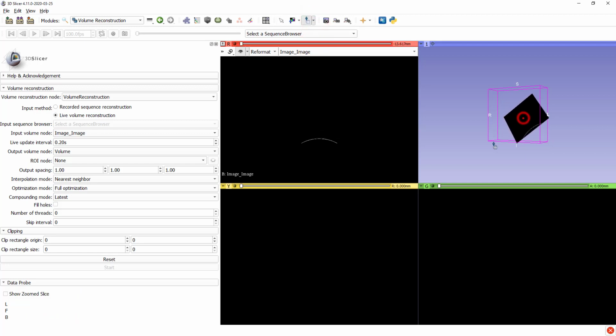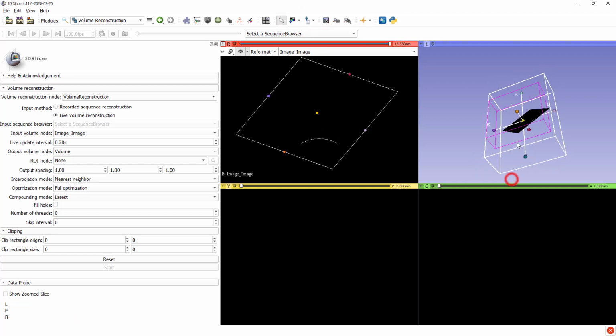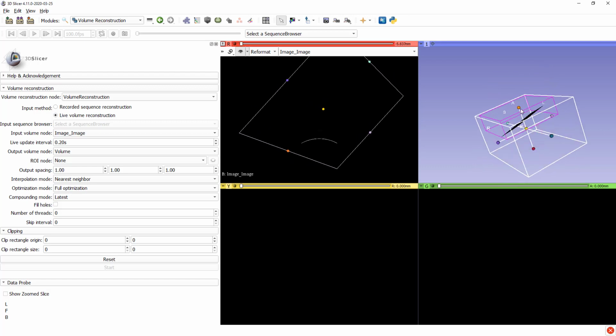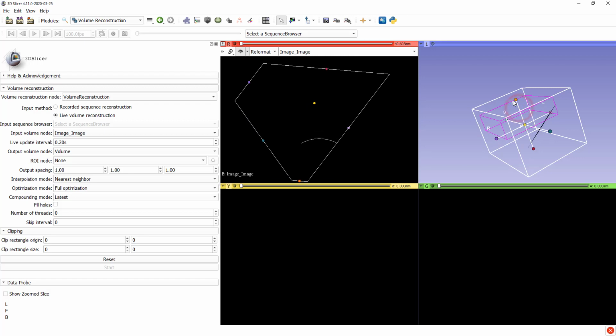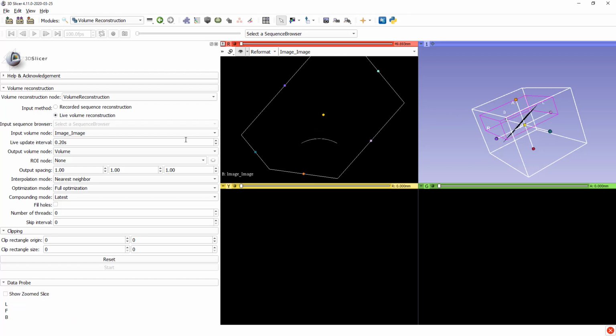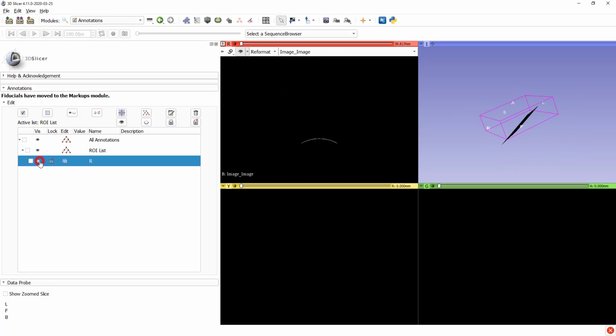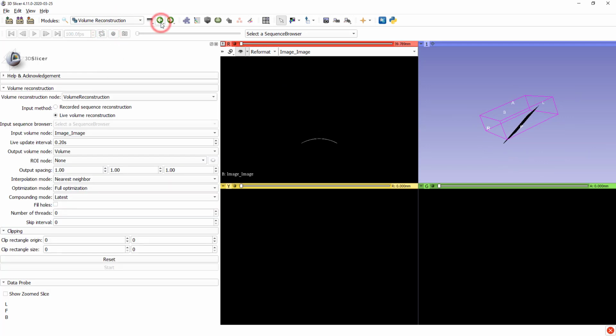For live volume reconstruction, we need a region of interest where the volume will be created. We can just click on our ultrasound image, place an ROI, and extend it to the expected workspace. After this, we can hide the ROI to remove clutter from the 3D viewer.